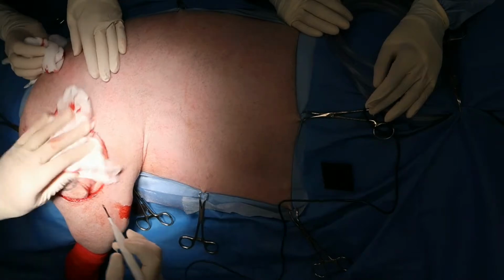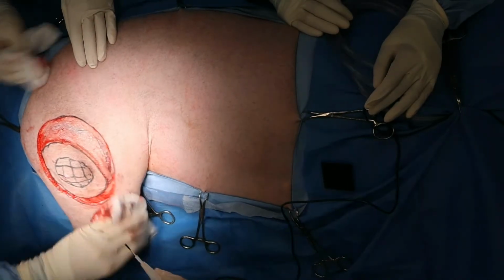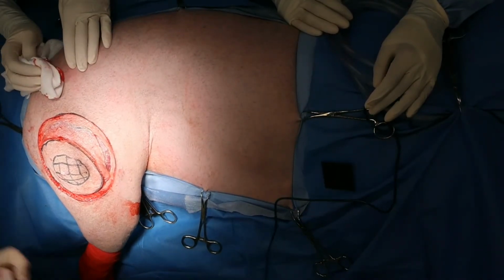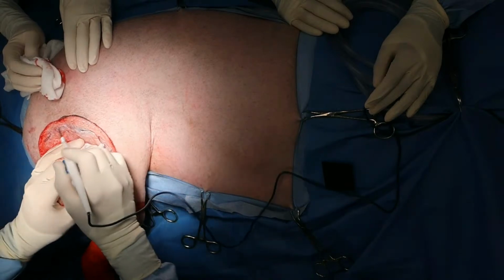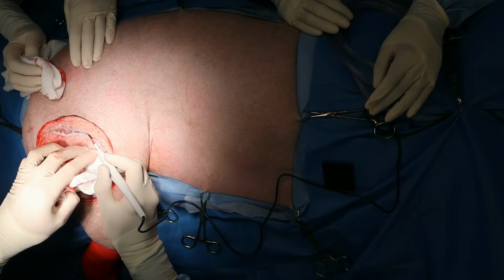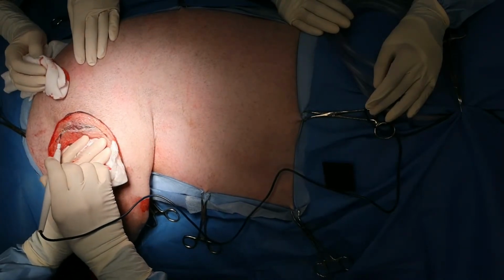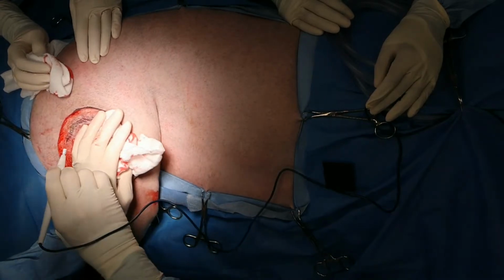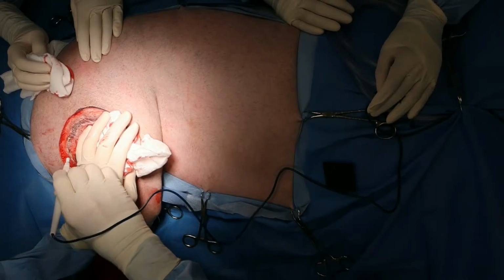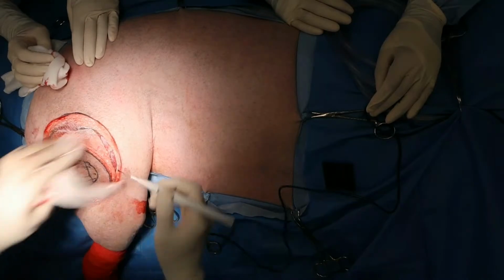Can I get cautery turned up, please? Maybe 45 and 45? Thank you. So that's biceps muscle there, and that's where it goes into muscle fascia, right there. So usually what happens is that I try to peel the fascia off, but as I go farther distal, I end up taking almost full thickness biceps.